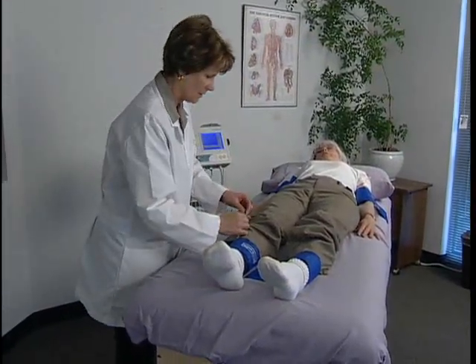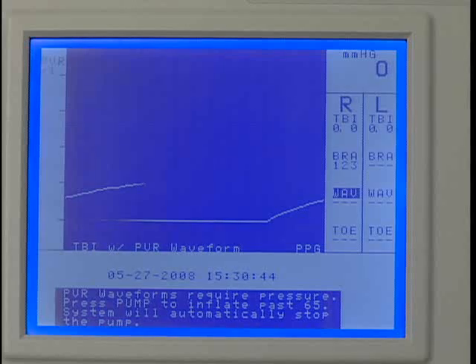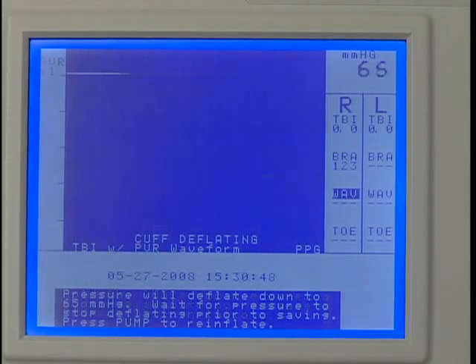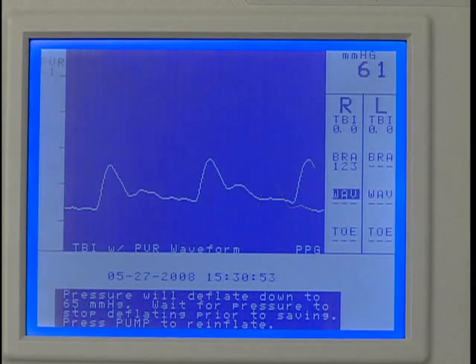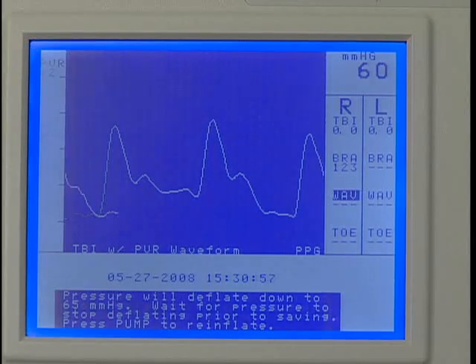Move the hose to the right ankle and connect it to the cuff. Press and hold Pump to inflate the cuff to 75 millimeters of mercury. Release when the inflation automatically stops. Pressure will deflate to 65 millimeters of mercury for optimum PVR. Wait for the cuff deflating message on the display to disappear.